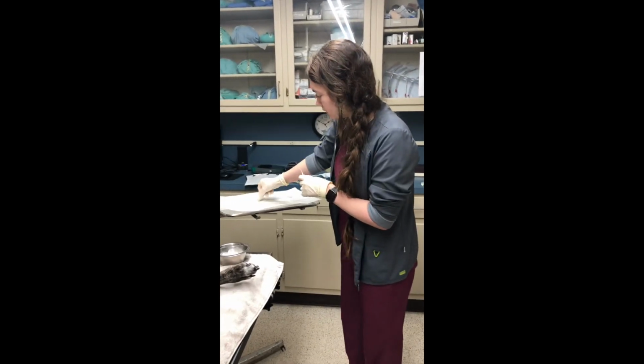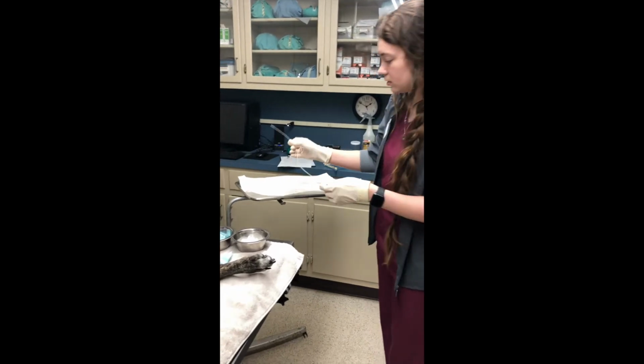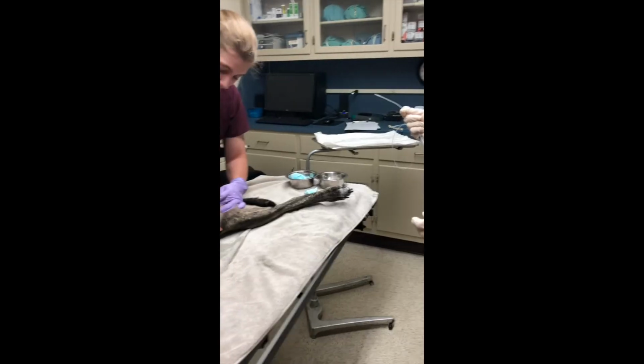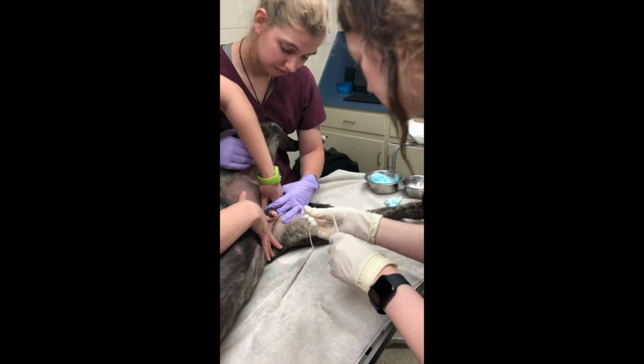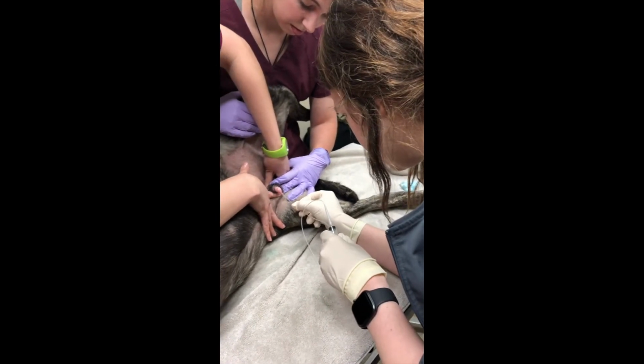Alright, and then I'm going to put lube on the end of my catheter. Okay, and I'm going to try to stay as sterile as possible.